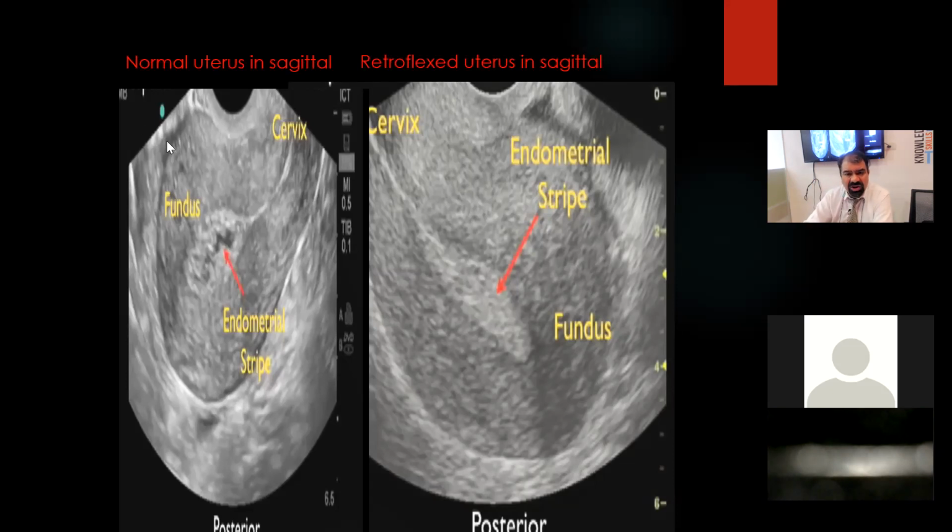What is that orientation for? If the small bladder is on this side, the fundus has to be on the same side. I am repeating. I want to show you the uterus here. If you have the bladder on the right side, for example, the fundus has to be on this side only, and then it is not a retroverted uterus.